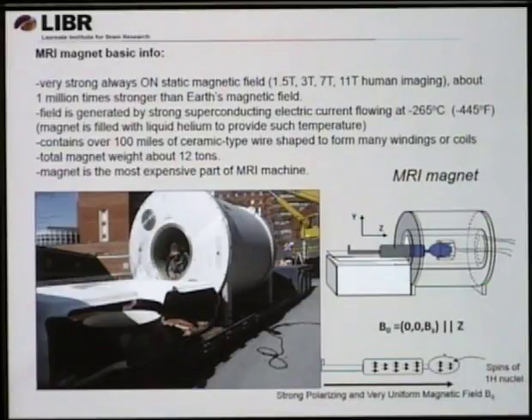Say, for example, if you have an old electric bulb in your house, you run electricity through this bulb, you cannot really touch it because it's so hot. The reason it's so hot is that we generate light in this bulb, electric current is flowing, but it is also producing a lot of heat. Inside the magnet, we don't want the heat, so we have to use different materials. So we cool down those materials to a very low temperature, a few kelvins, which is like the temperature in space, with liquid helium, which is a very special liquid gas, really.